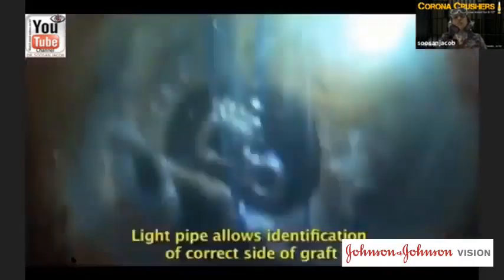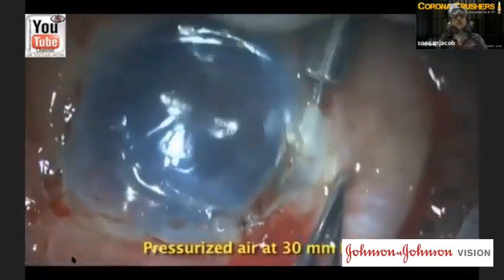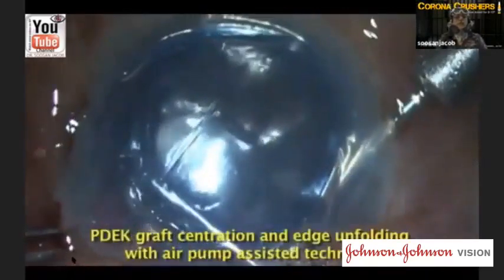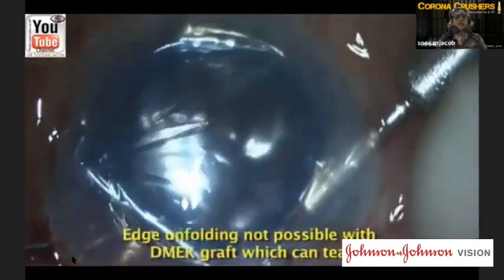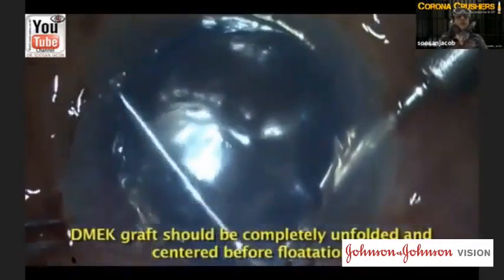You can see that that air pump assisted technique really helps you in doing a lot of maneuvers, holds the antechamber well open. That was the endo-illuminator assisted technique, showing you the graft orientation. I've got the air pump back in. It's pumping in air at about 30 millimeters mercury, and you can do this with either the vitrectomy machine or with newer phacoemulsification machines like the Stellaris.